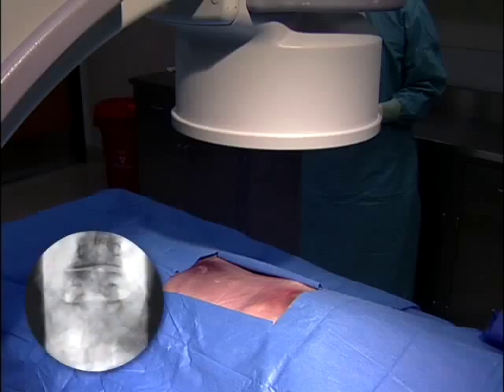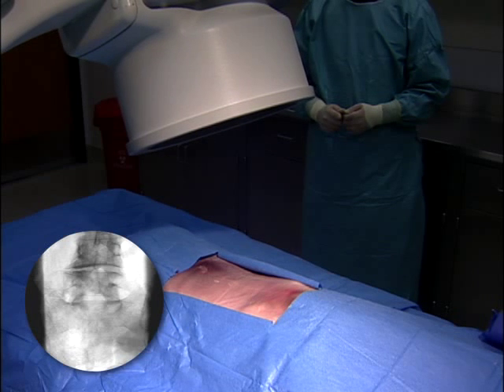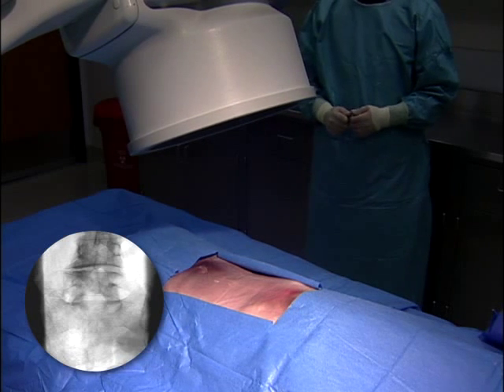A series of lateral and AP fluoroscopy images are used to target the appropriate spinal level, the start point on the facet, the trajectory of the implant that is to be placed, and the entry point on the patient's skin. The AP view should be adjusted for the lordosis of the lumbar level which is being treated. This is done by keeping the end plates of the disc level to be treated parallel to each other and should appear as a line.